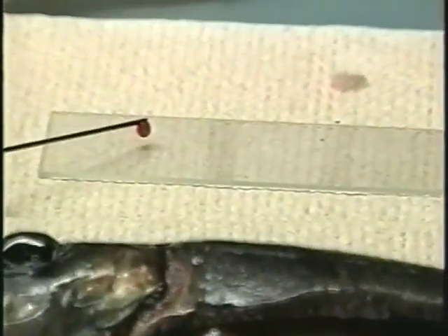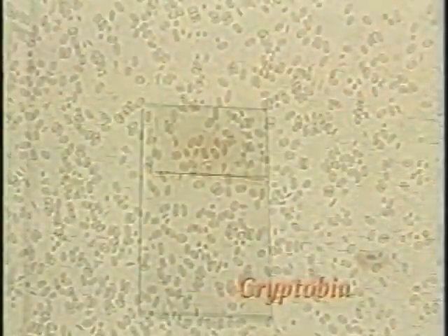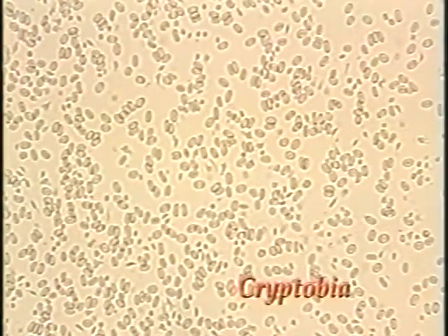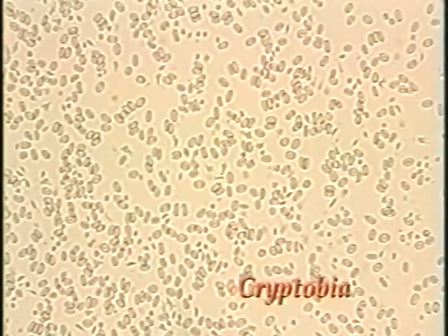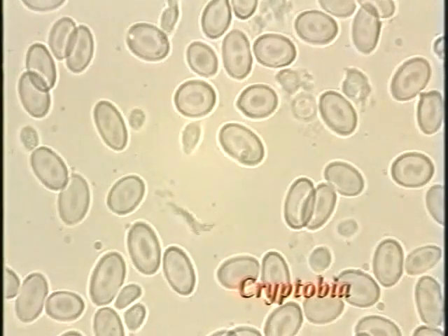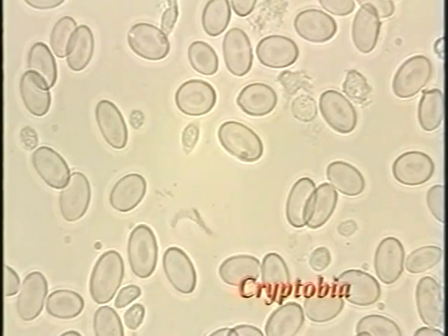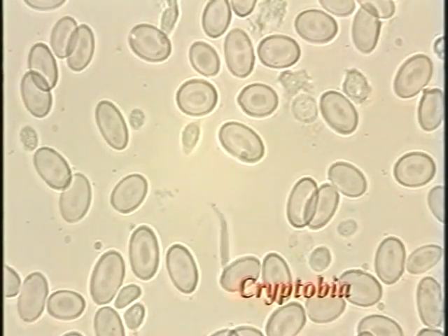To detect flagellates, dilute a drop of blood in phosphate buffered saline on a microscope slide, apply a cover slip, and examine immediately. Blood flagellates are motile and will be visible using the 10 to 20x objective. A blood smear should also be prepared and fixed in methanol for later staining and examination. Stages of certain myxozoan parasites may be detected in wet mounts or stained smears.